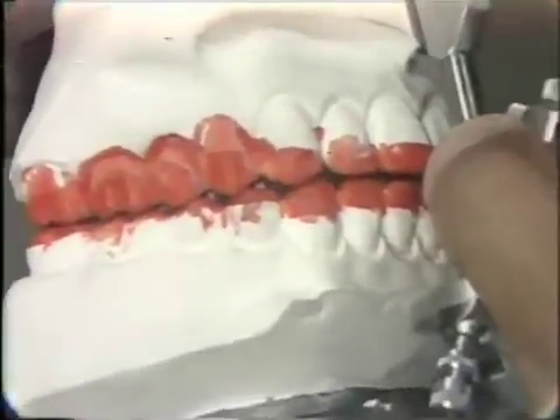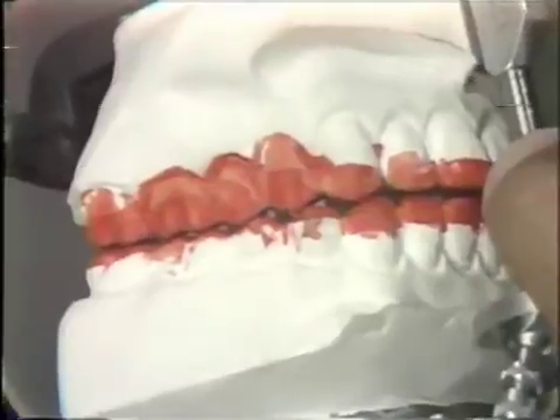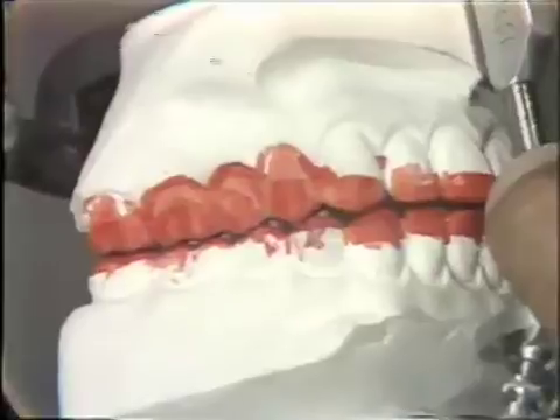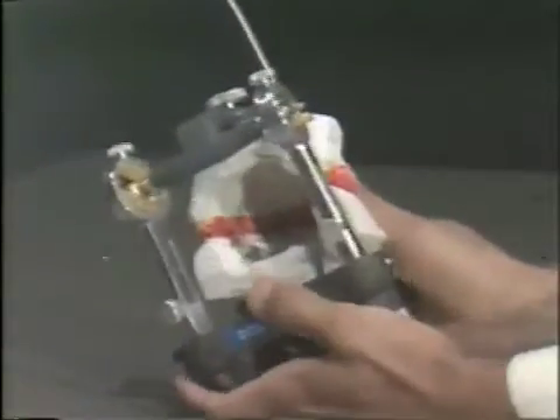We can see through all of the buccal cusp and the cusp of the cuspid on this side. So that means either there is a contact on the lingual in the working excursion or there is a balancing contact on the other side. As we turn this around from behind, we will see that there is a contact either on the first or second molar on this side in the balancing excursion.